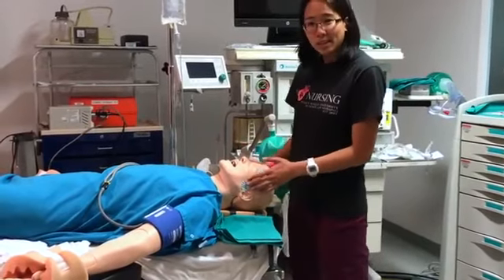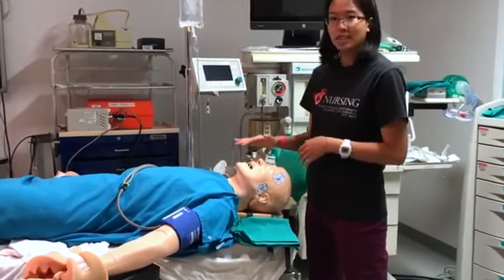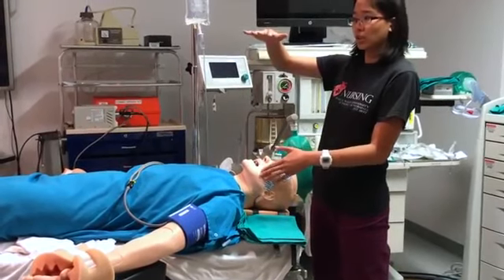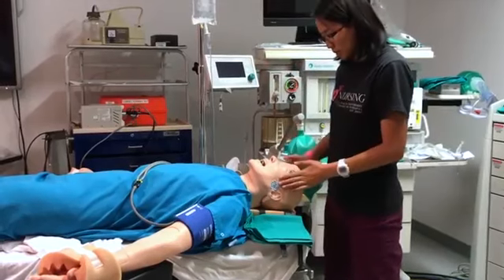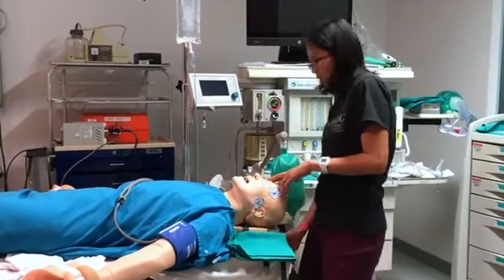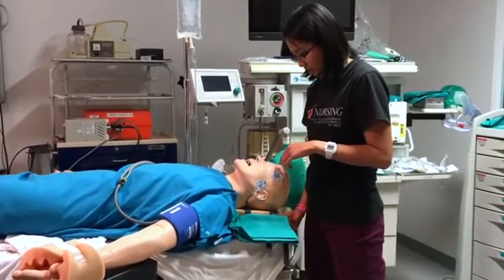I want to talk a little bit about positioning. It's important that the patient is positioned appropriately. That way you don't hurt your back when you're leaning too far forward and the patient's too short, or if the patient's too tall on the table, then you can't maneuver well when you intubate. So it's important that the mouth is about level with your xiphoid process. So right now the patient's too low, so I'm just going to move him up.